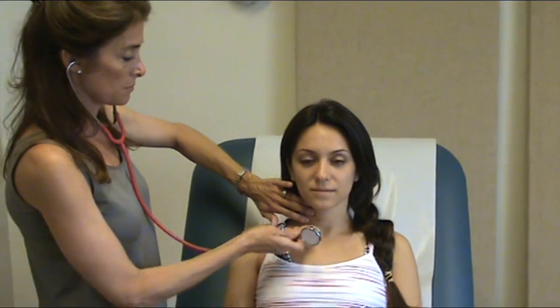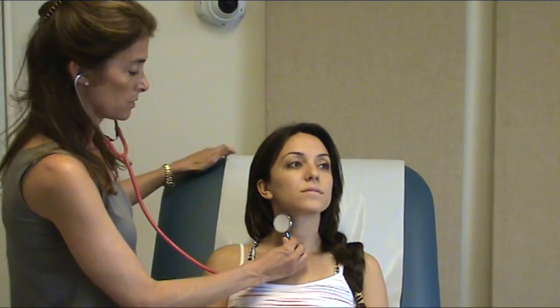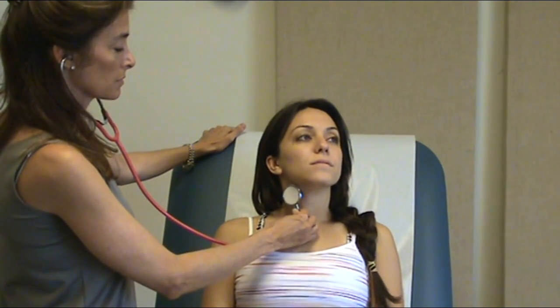Locate the carotid. Place the bell of the stethoscope. Ask your patient to take a deep breath and hold it. And breathe.